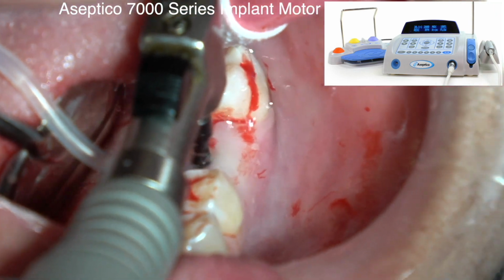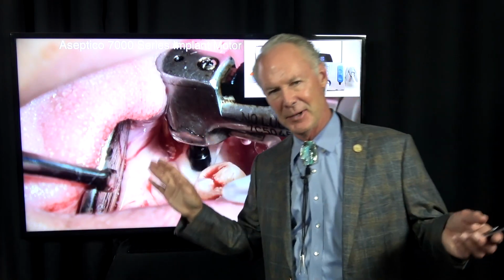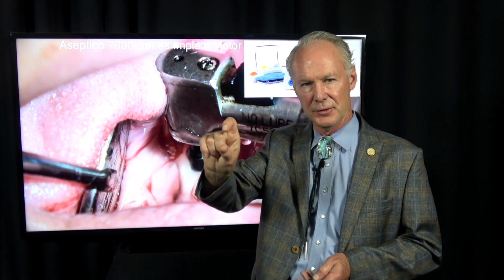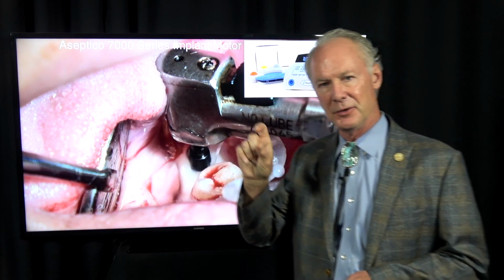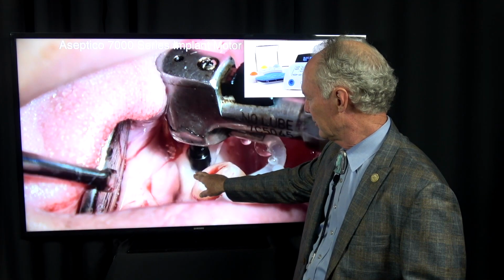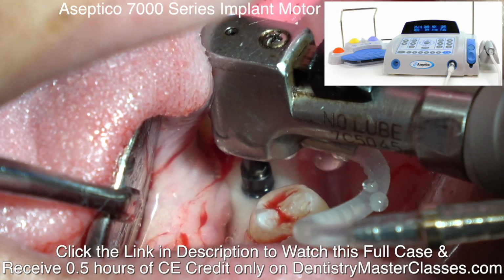So I'm starting with a 2.2 millimeter width, but see, the shoulder stops it. So I don't have to think about the depth anymore. Now, the other thing I like about this technique is because I'm not reflecting a flap, I don't have to suture the flap, and I don't have to judge how thick the gingival tissue is. I'm saying the gingival tissue is 2 millimeters, and so if I'm using a 14 millimeter drill, then I know my implant is going to be 12 millimeters. I subtract 2 millimeters for the tissue. The tissue is going to stop the drill, and if it's 14 millimeters, then the implant in the bone is going to be 12 millimeters.